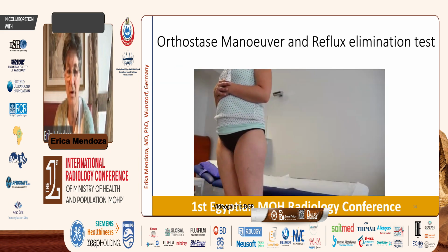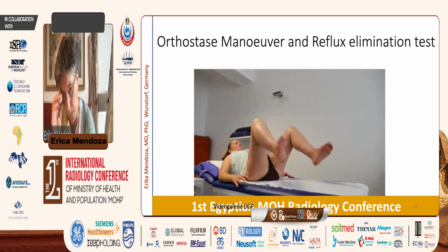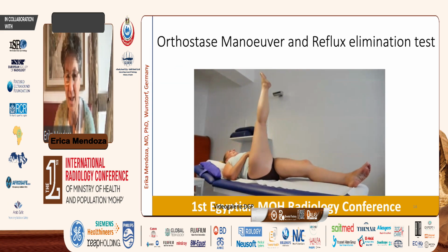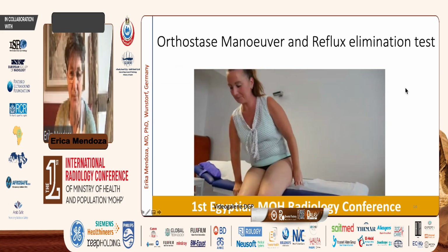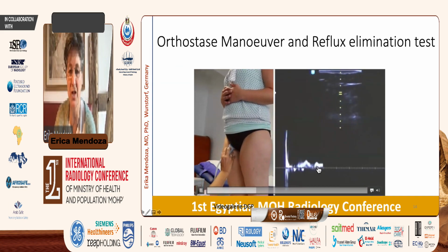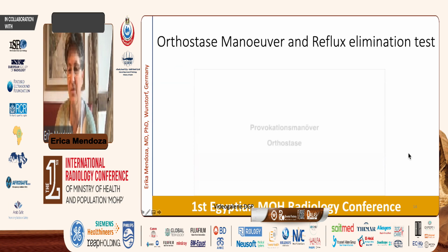There is no flow with provocation maneuvers, and then the lady lies down. I've cut the film, obviously I won't be here 20 seconds waiting. And then she gets up again. And you have to remember where to position it, and it flows and flows and flows, and it can take 20 seconds, 2-3 minutes flowing back. This is very interesting.